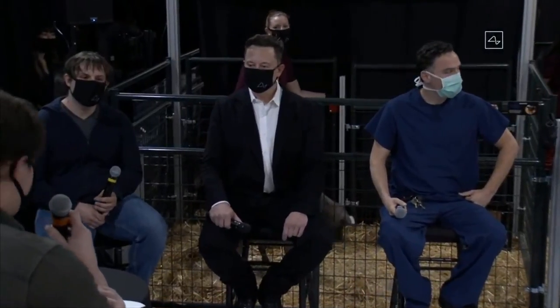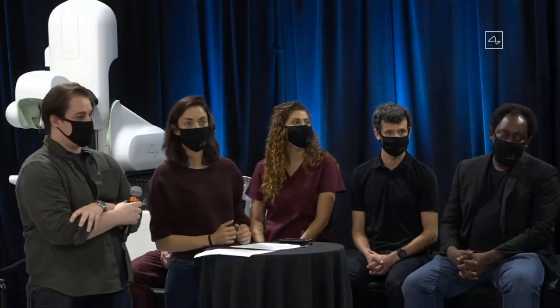Thanks, Matt. Is there anything specifically from the robot that can be done to make this faster and safer and scalable to billions of people? Yeah, I guess we've started with just implementing robot manipulating the threads. But we definitely need to expand to essentially doing the entire surgery with the robot. There's nothing, as far as I can tell, fundamentally stopping us from doing that at a fundamental science level. It hasn't been done in the past, I think, probably just because volumes of surgeries haven't been needed. But specifically for us to scale up to many hundreds of thousands or millions of patients, we will need to automate the entire surgery essentially.